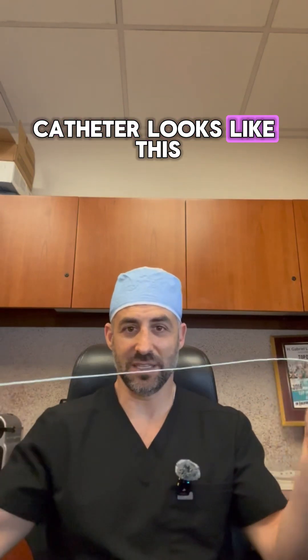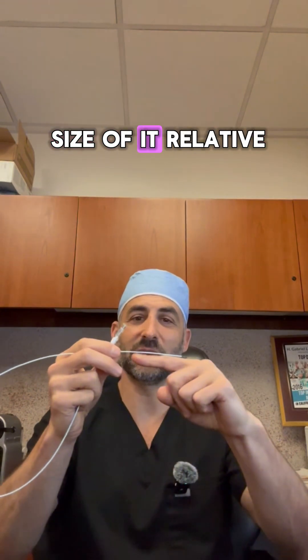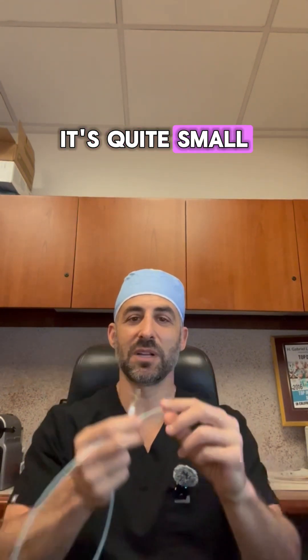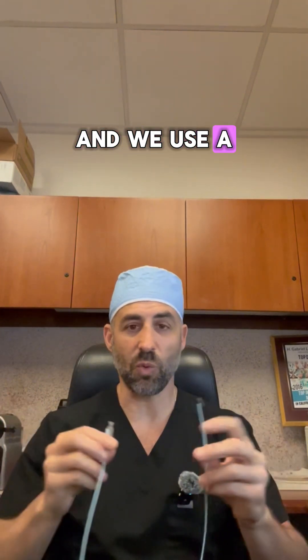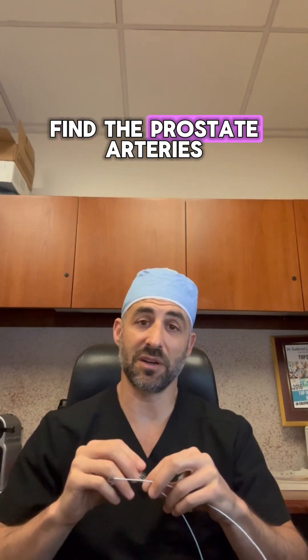The catheter looks like this. It's basically a very small hollow tube. You can see the size of it relative to my finger. It's quite small and we use a wire basically to navigate our way through the arteries in order to find the prostate arteries.